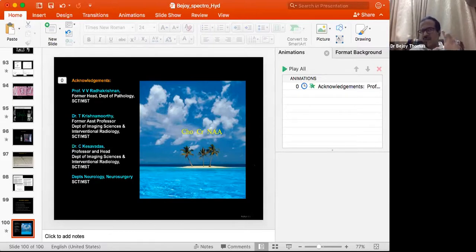They were using, I think it is the right or left basal ganglia, and the opposite peritrigonal white matter for another spectrum. So if you are looking at a normal spectrum. Another very interesting thing is that you can actually do real-time spectroscopy, like our postdoc student Anupa has done. When you are acquiring a spectrum, you can see it in real time.